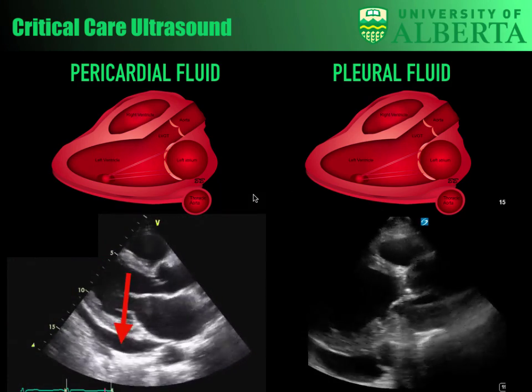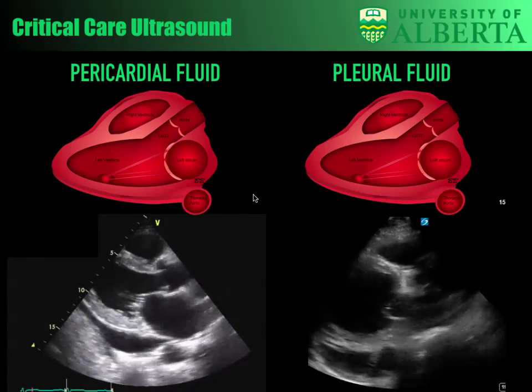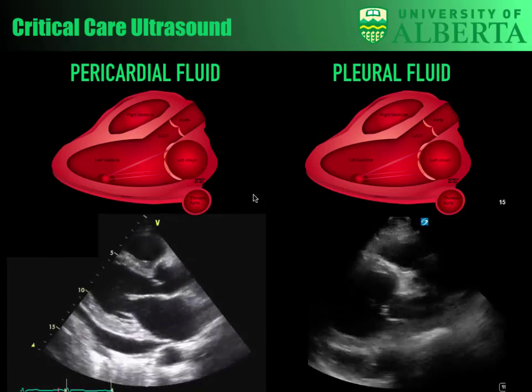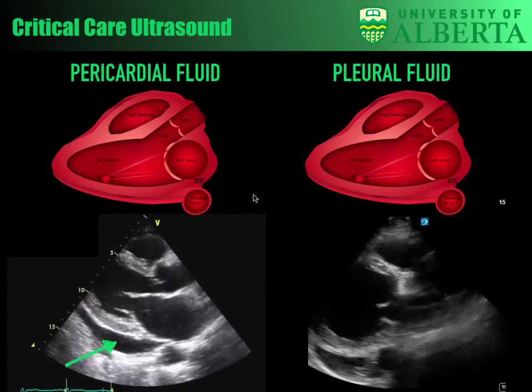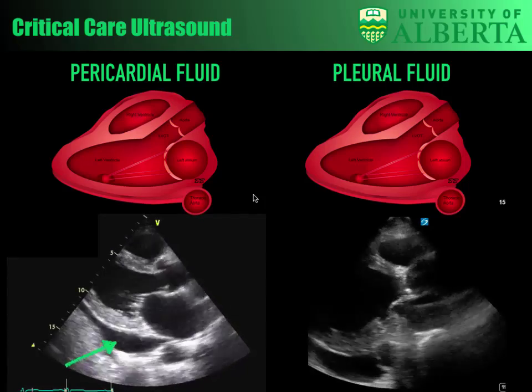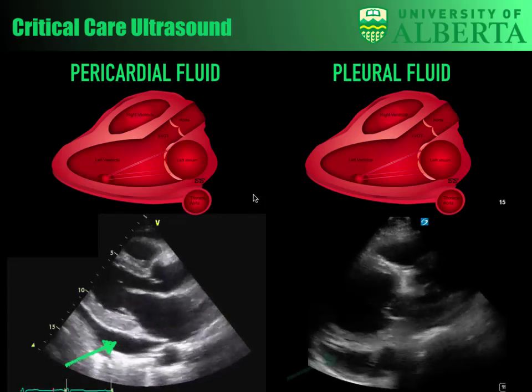Yeah, it's left-sided, because of course the cardiac chambers are predominantly in the left side of the thorax. You may occasionally see an effusion, or anechoic space, to the right of the ascending thoracic aorta, which could be a right pleural effusion, but it's not common to see that. On the right, you get a tension right hemothorax, for instance. It's not actually the fluid that'll cause the RV compression, it's the mediastinal shift. So the fluid won't be there, but the shift will cause compression on your right side. Yes, so you're right, far more rare. Definitely not as common.